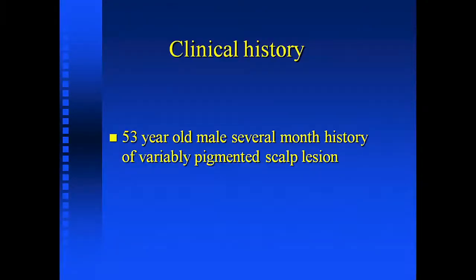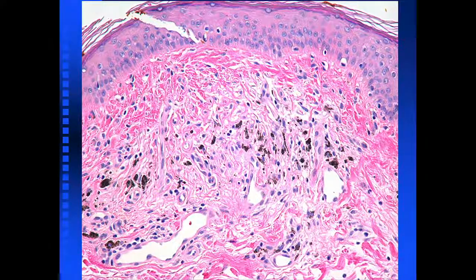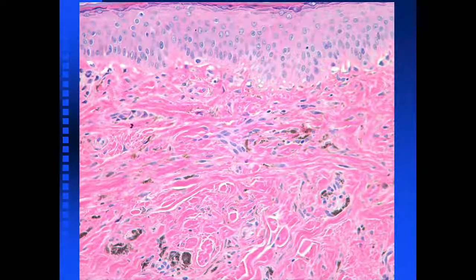Let me tell you about a case that really happened at Mount Sinai. We had a 53-year-old male with a several-month history of a variably pigmented skin lesion. The biopsy shows a row of melanophages, a little bit of coarse fibrosis in the dermis, and prominent vessels — not much at the dermal-epidermal junction. Another view shows this coarse collagen and variable pigments in the dermis.